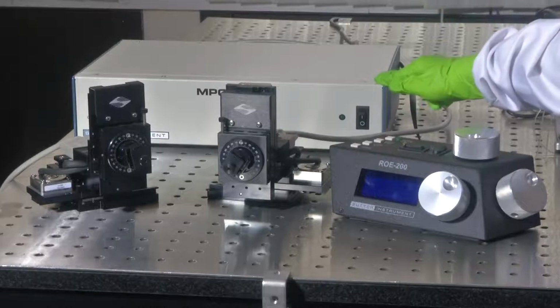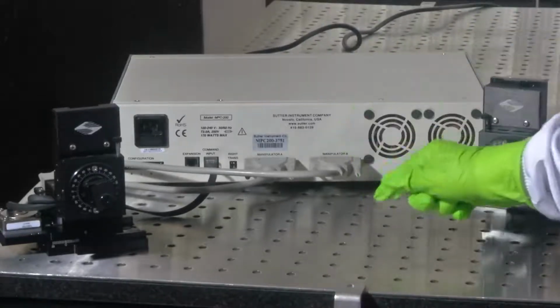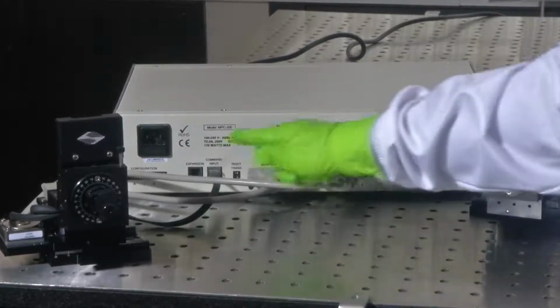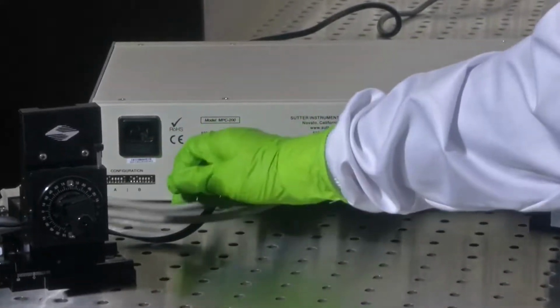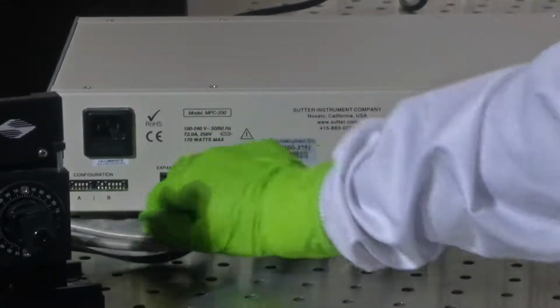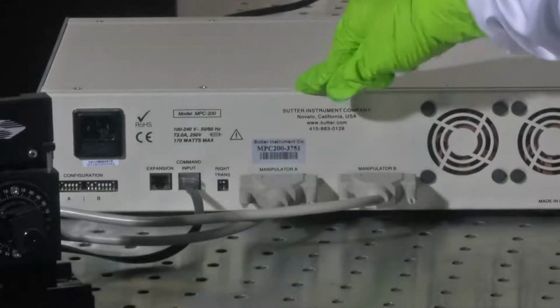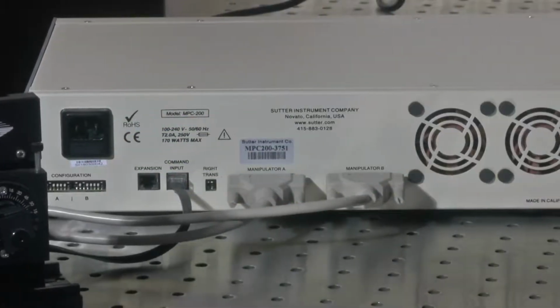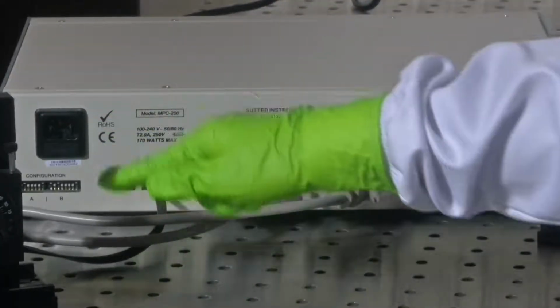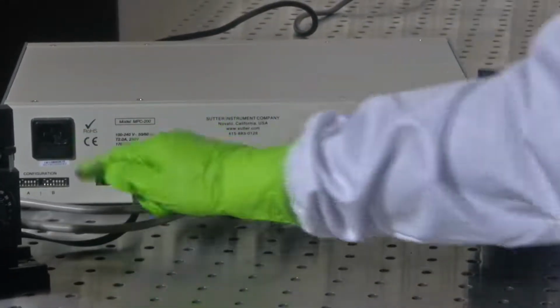Coming to the main unit, I have flipped it around so that we could study the different components which go from the main unit to the other units. So, here is your power cord, and this is the configuration port A and B, and here we have an expansion unit. For now, we have two manipulators being supported. So, the expansion port is for further extension. You could have more manipulator arms connected to the unit, and hence the expansion port.